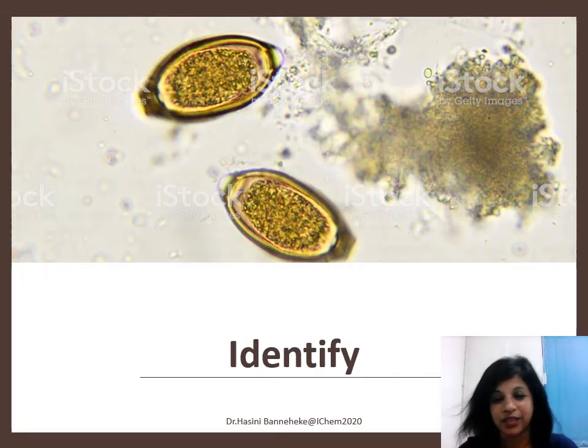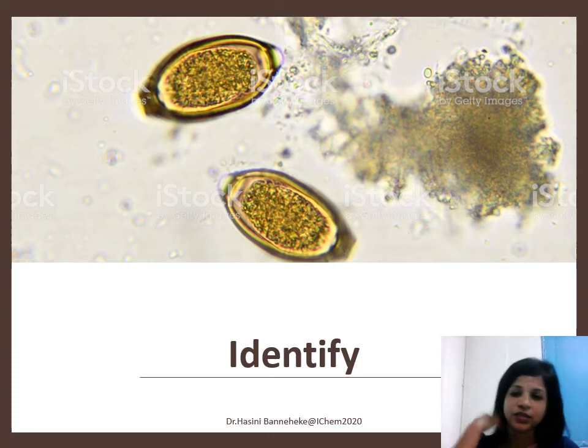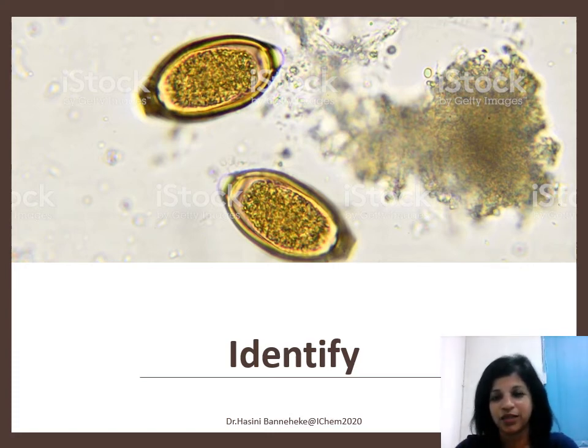So this is one of the easy spot tests for students, because it's quite easy to recognize this structure, because there is no confusion with any other structure. This is again present in fecal material. This is again from a normal saline smear. You can see the shape and the other internal structures, which will help you to recognize which species it belongs to.